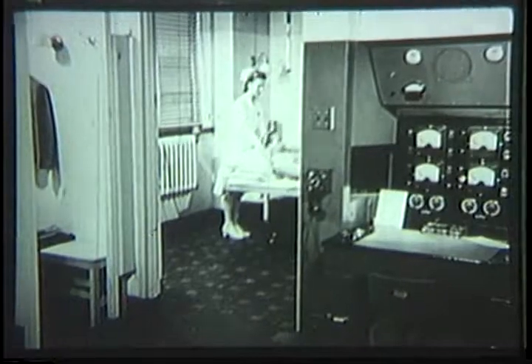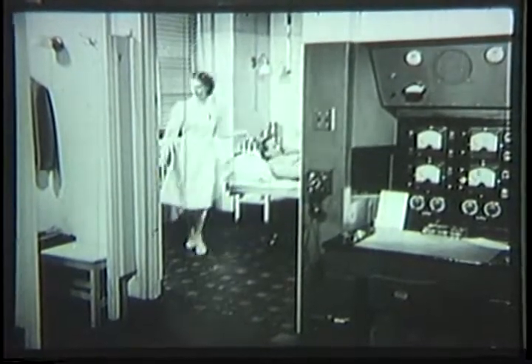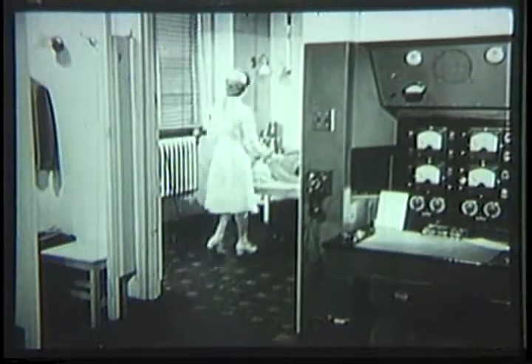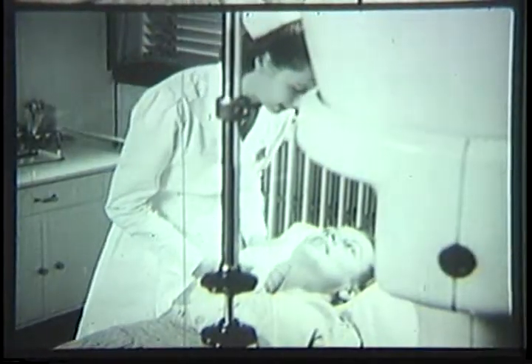The patient is made as comfortable as possible and instructed that she must not move during treatment. Sandbags provide firm support.